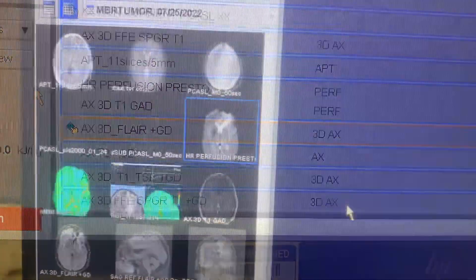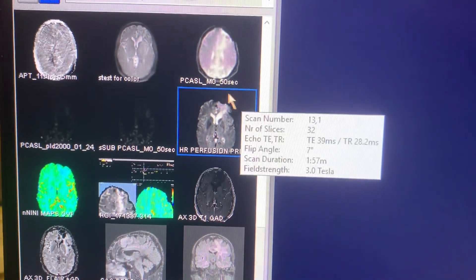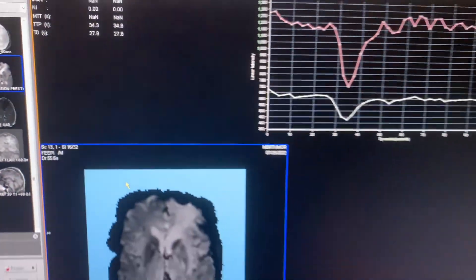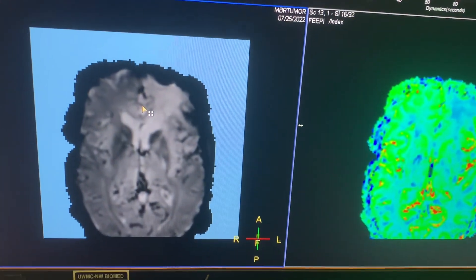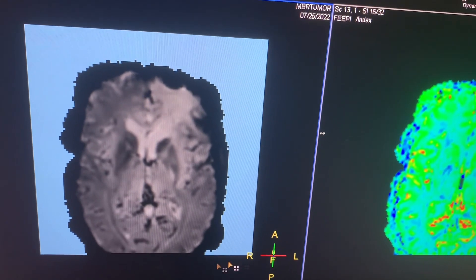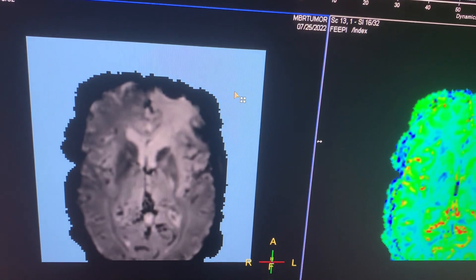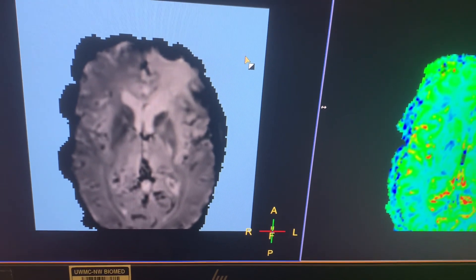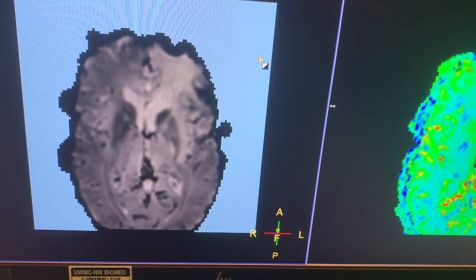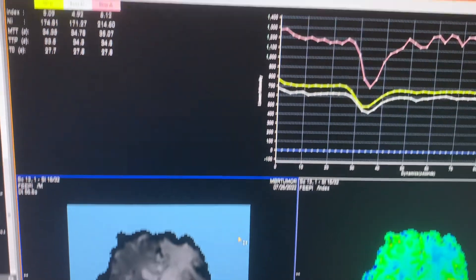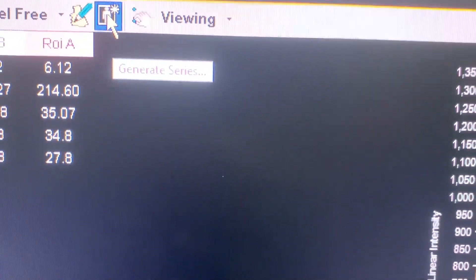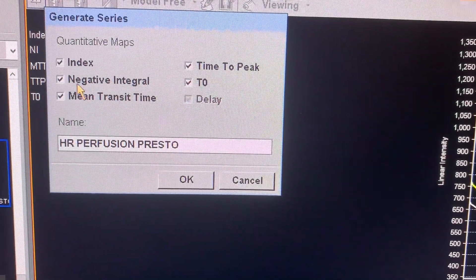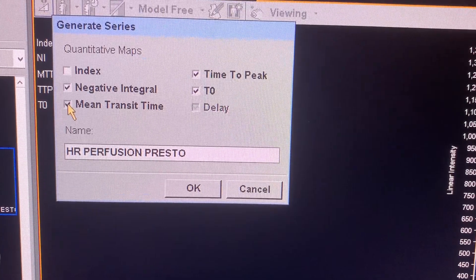Moving on to the post-processing section. For high-resolution perfusion post-processing: right-click on the perfusion sequence and go to NeuroPerfusion to load it into the app. In the bottom-left corner you'll see a blue area — clean up any artifacts or debris around the brain margins just like you would for brain or prostate perfusion. Once clean, go to Generate Series and leave only the NI checkmark selected, removing the rest.